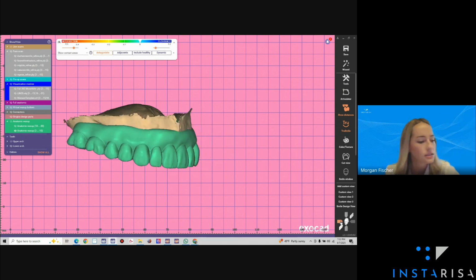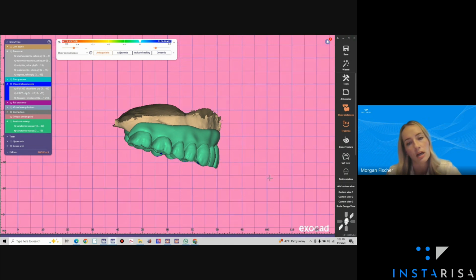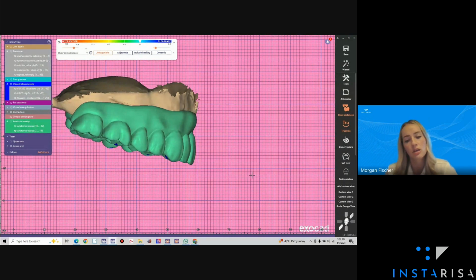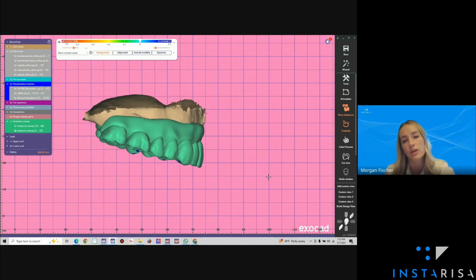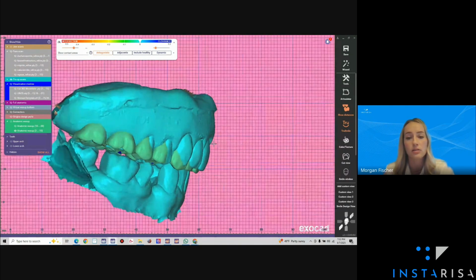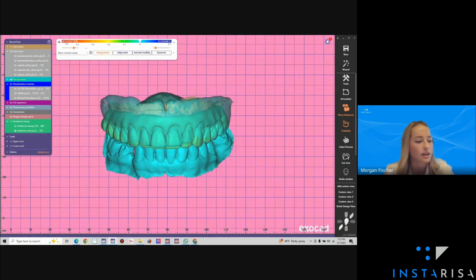And then next step number 9, I always like to just check the buccal facial proportion here. So and also keep it in line with the pre-op. I knew that she had a lot of lip support, and I'm okay to bring that in. I need to bring it in anyways over the ridge, because this would be way too much of a flange if I left the incisal facial portion where it was. That's going to be too much of a flange here and create a kind of a shelfy prosthetic.